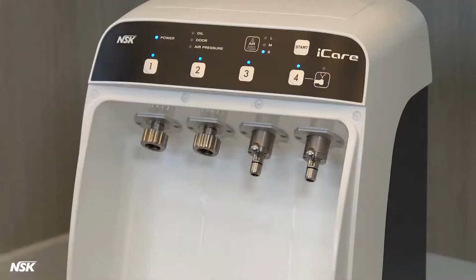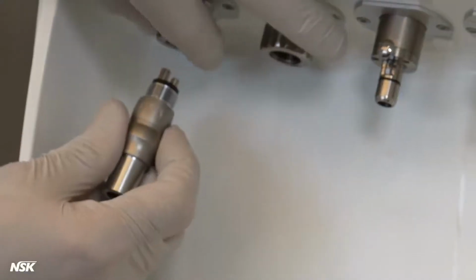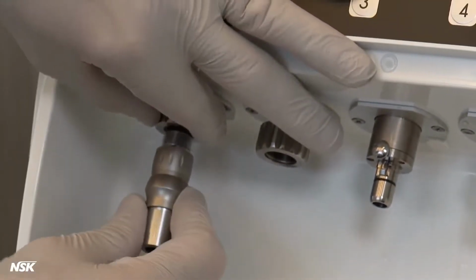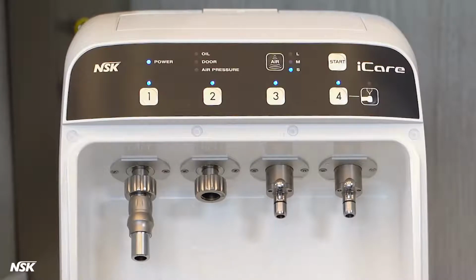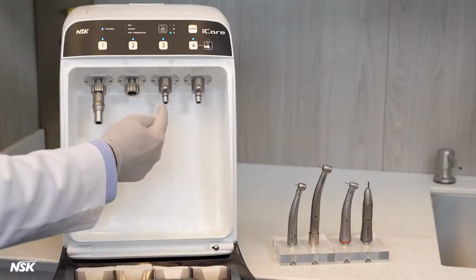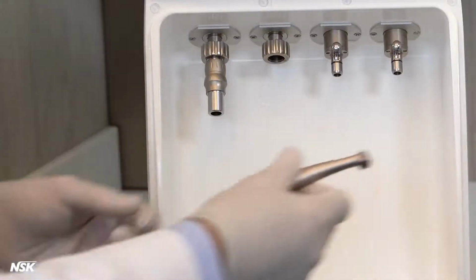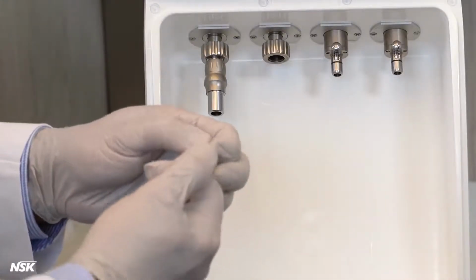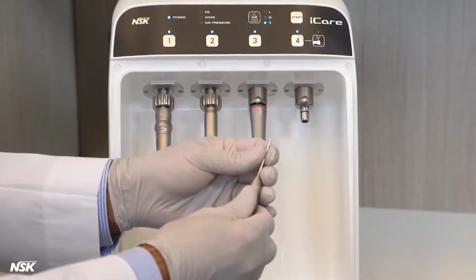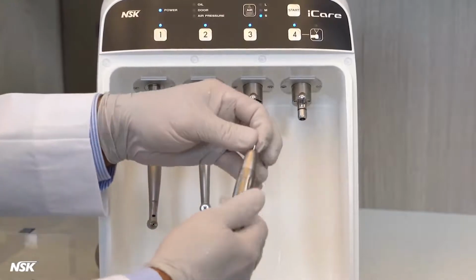Open the front door. Adapters are available for all the major brands of high and low-speed air-drivens to work with your iCare. Here, we connect an NSK adapter to port number 1 and leave port number 2 for a non-coupler or a direct connect high speed. Always make sure connections are tight and secure. Port number 3 and 4 can be used for electric or air-driven E-type attachments. Be sure to remove the burr for high or low-speed handpieces. The only exception is the E-type straight nose cones. The dummy burr needs to be mounted on these handpieces so they can rotate while being lubricated.